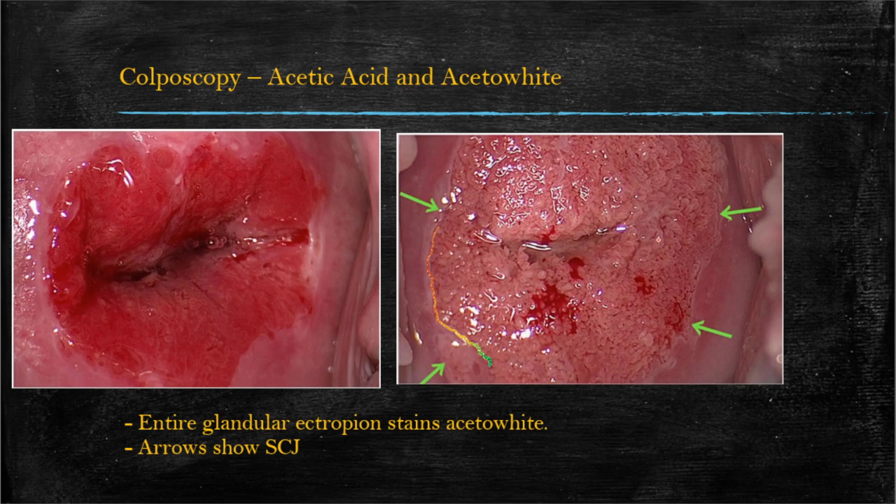So you can see this kind of thick cobblestoning sort of appearance. It's a bit friable. This, at first inspection, especially to an inexperienced eye, could be read as being quite abnormal, but this is just that big kind of eversion of the columnar cells coming out. And again, that area of metaplasia is happening here.